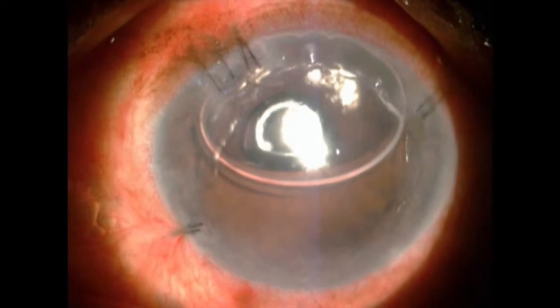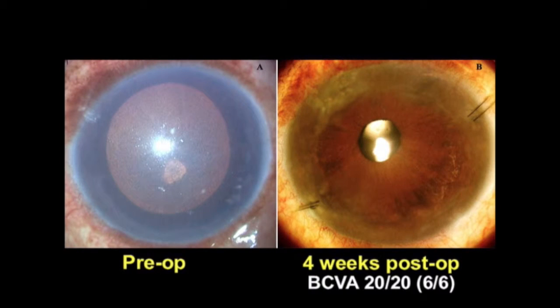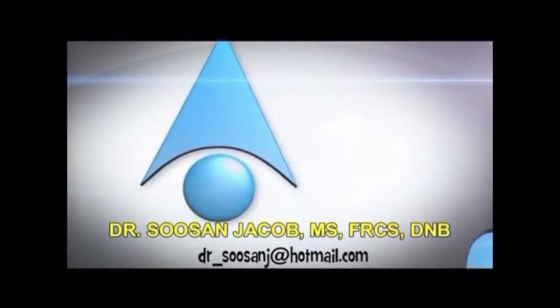But you'll see that little bit of touch, even though you do, it makes it worthwhile to not have done much more maneuvers which you might have ended up doing without this technique. This is the 4-week post-operative appearance of the same patient, and you can see he's got a very clear cornea, and he was at 6/6 vision, now 20 by 20.